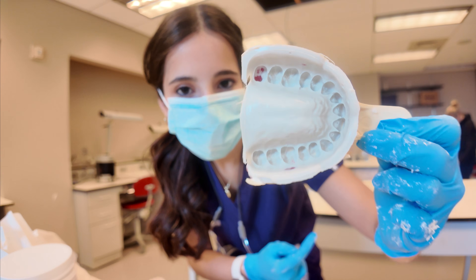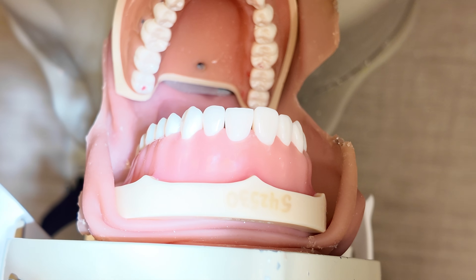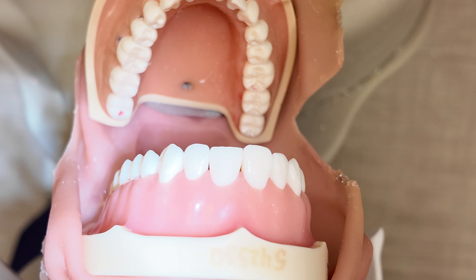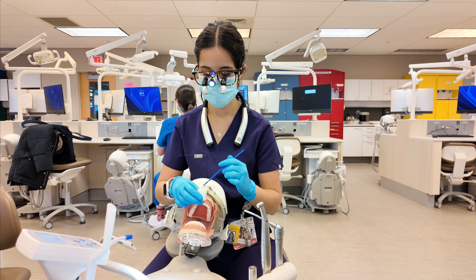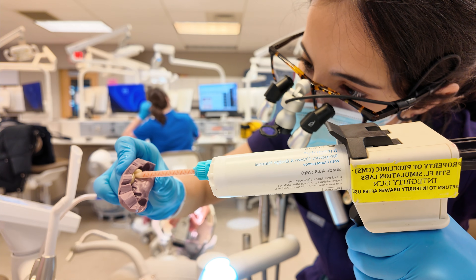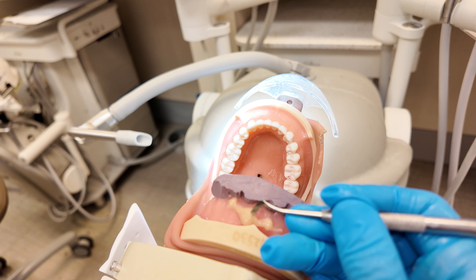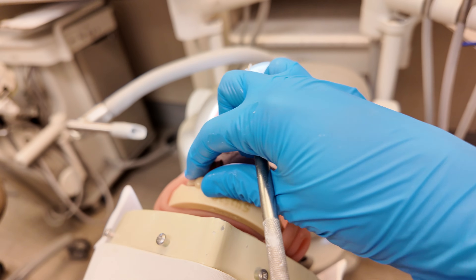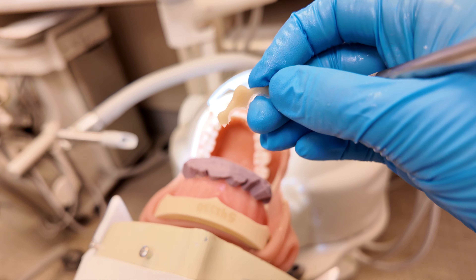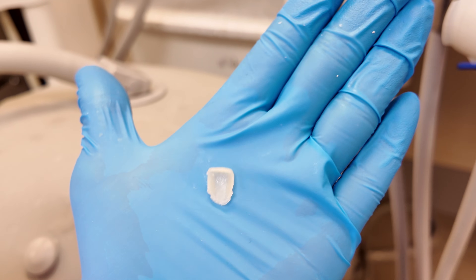Next, I poured up some dental stone and poured it onto my impression. While my cast was setting, I started a different project for Fixed Pros, where I made a provisional for my veneer prep. We prepped the veneer a few classes ago and the next assignment was to make a provisional for it. So I Vaseline'd my teeth, put the provisional material in the putty, and then set it on the tooth. I waited a few minutes and then took it out, and that was it.